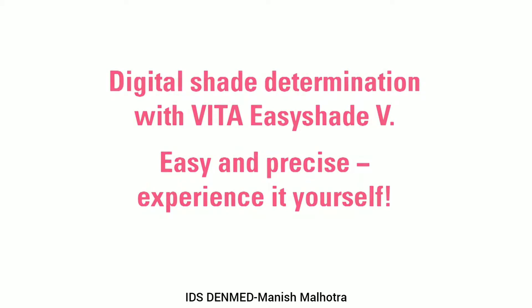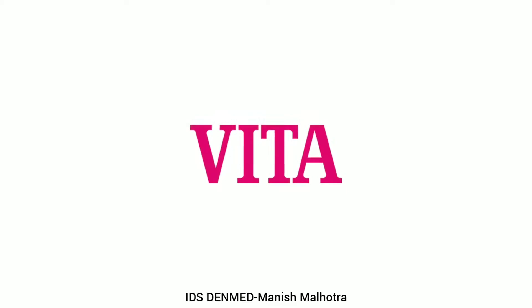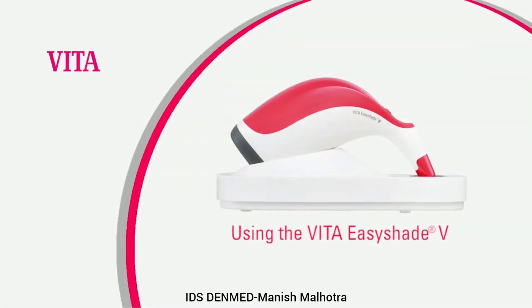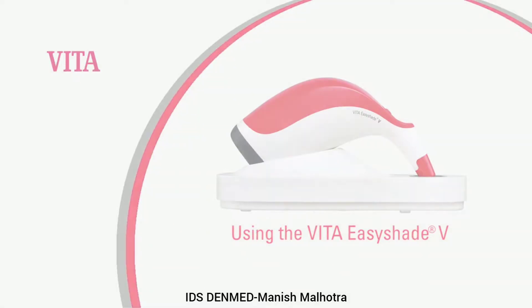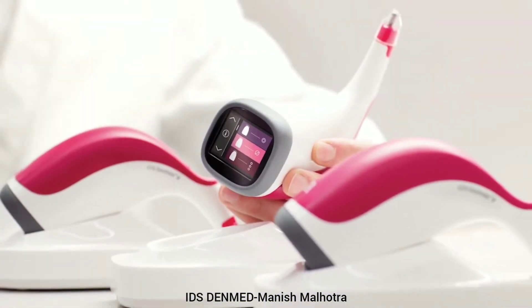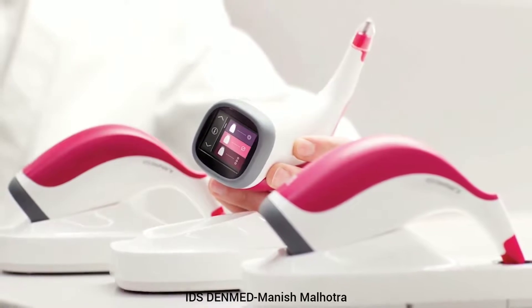Welcome to Vita North America. Measuring shade has never been more innovative and precise. The new Vita EasyShade 5 features an intuitive touchscreen color LED display and inductive charging. This video will demonstrate step by step how easy it is to operate the new EasyShade 5.